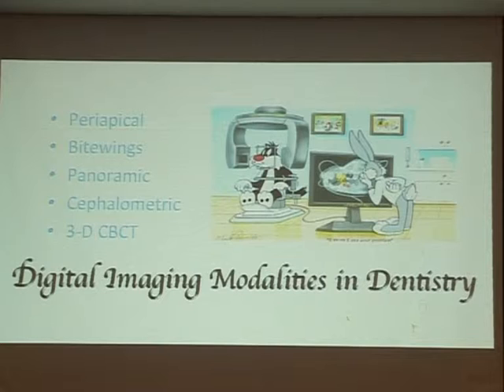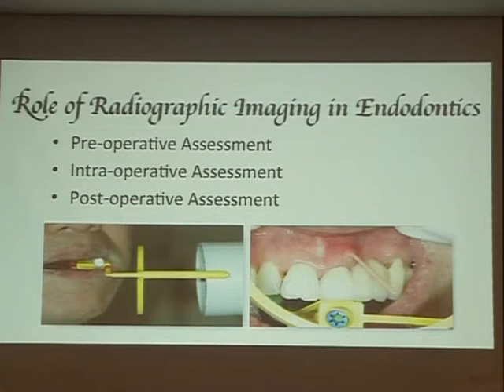How about digitals? Okay, it's a trend in digitals. I'm using all digitals. It's very useful in intraoperative and postoperative. So this is a master cone, sinus tract tracing with the GP cone before we take the X-ray. So you can see how we can position the film holder in a true parallel technique.